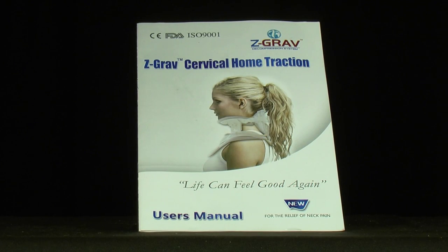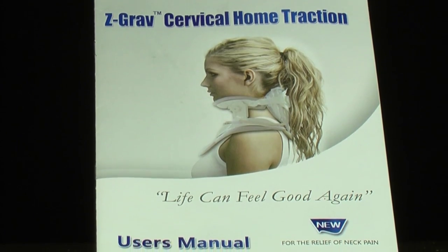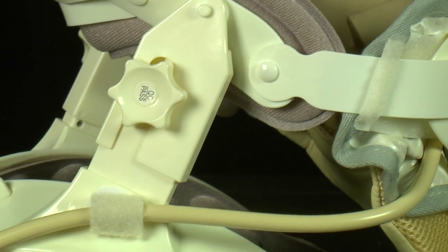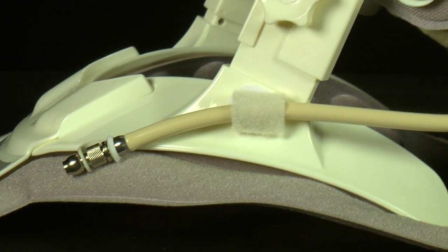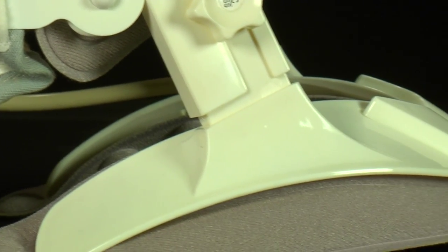This video is designed to visually demonstrate the instructions provided in the manual that accompanies the Z-Grav device. To start, please review the commonly used names when discussing the Z-Grav device. This will help for quick reference.